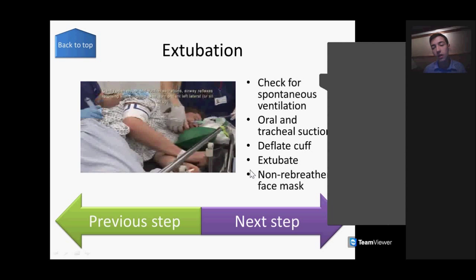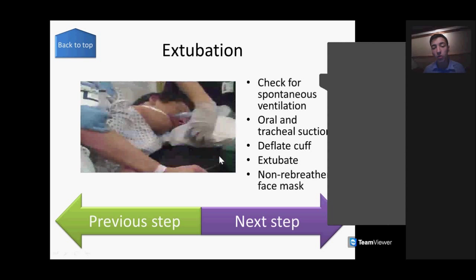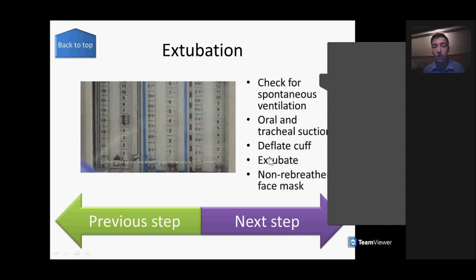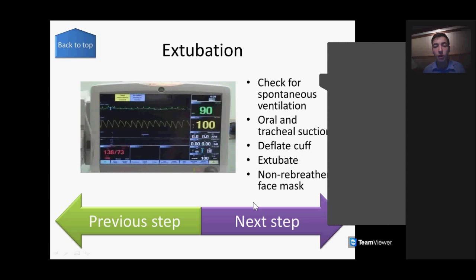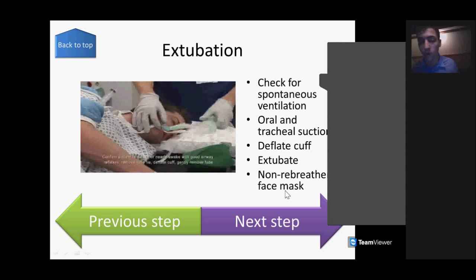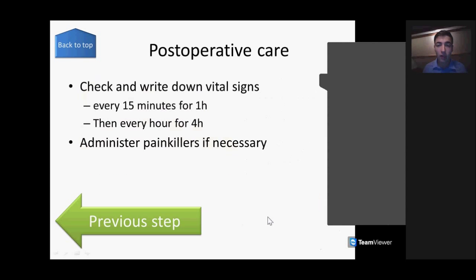So on the mannequin, you can just remove the tube, deflating the cuff obviously before removing the tube, and then after extubation, apply oxygen using just a face mask. And then basically that's it.